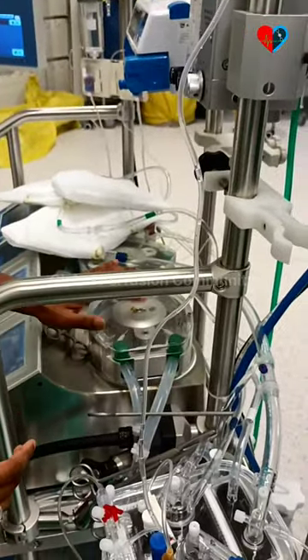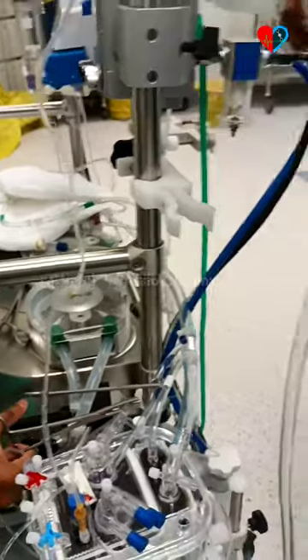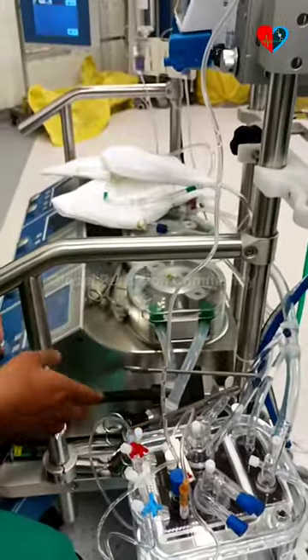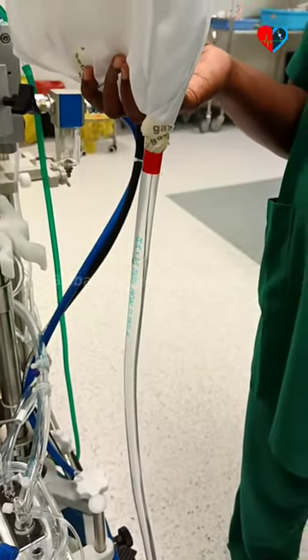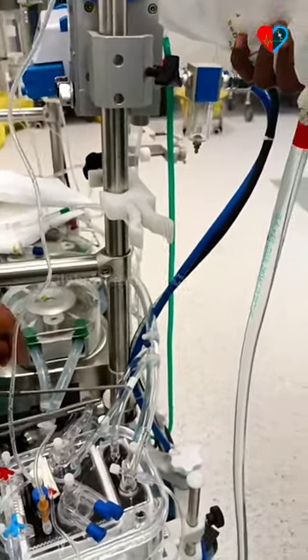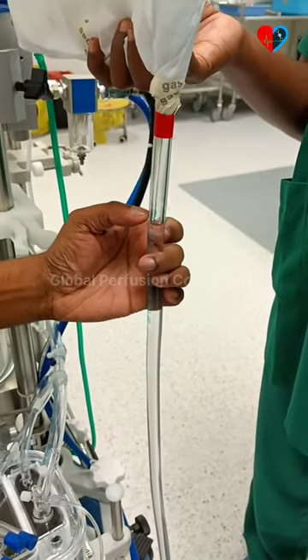We will bring the fluid back down by opening a recirculation line, then bring it back up so that the other roller also comes into position. We set the roller position and again bring the fluid level up.